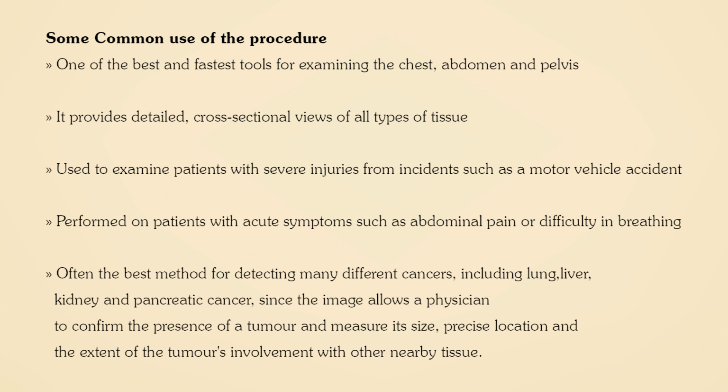It is often the best method for detecting many different cancers including lung, liver, kidney and pancreatic cancer, since the image allows a physician to confirm the presence of a tumor and measure its size, precise location and the extent of the tumor's involvement with other nearby tissue.